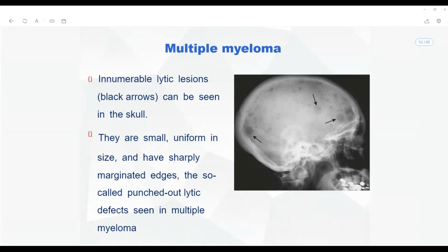The differentiation of bone metastatic lesions, neoplastic diseases of the bone, or bone cancers is done depending upon their distribution in the epiphysis, metaphysis, and diaphysis, and the surrounding soft tissue structures.